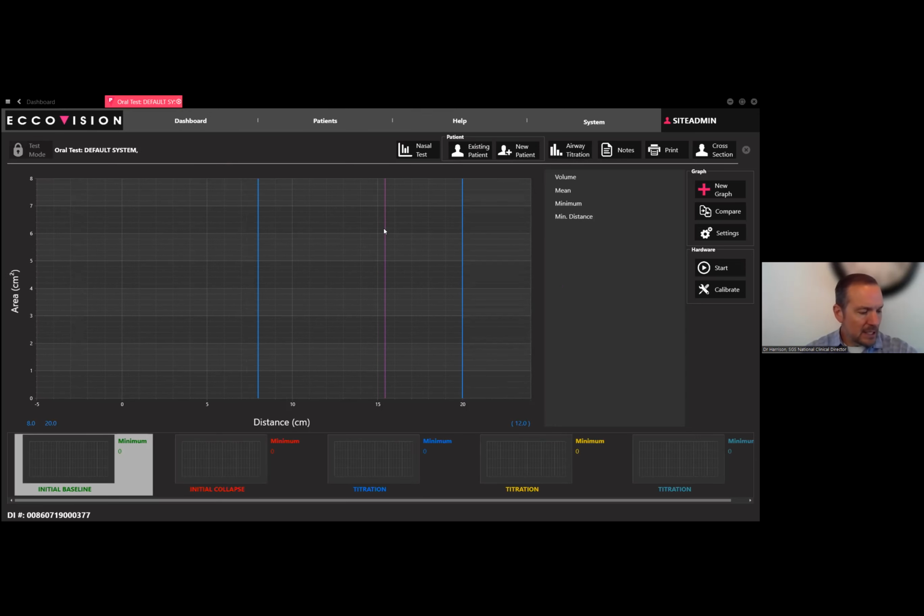And for those that can't see the screen, pharyngometry is basically a mouthpiece, like a snorkel would use. And for this test, we're going to hold the instrument, and I should probably unblur my background. There we go. We're going to put this in the mouth. Teeth come together, upper arch to lower arch. Tongue goes underneath. That's the tongue depressor, so the sound can get past the tongue. Now that totally rocks your world, I understand, because it's far from the spot, but we need to be able to get the sound past it. So again, this is just for the measuring.